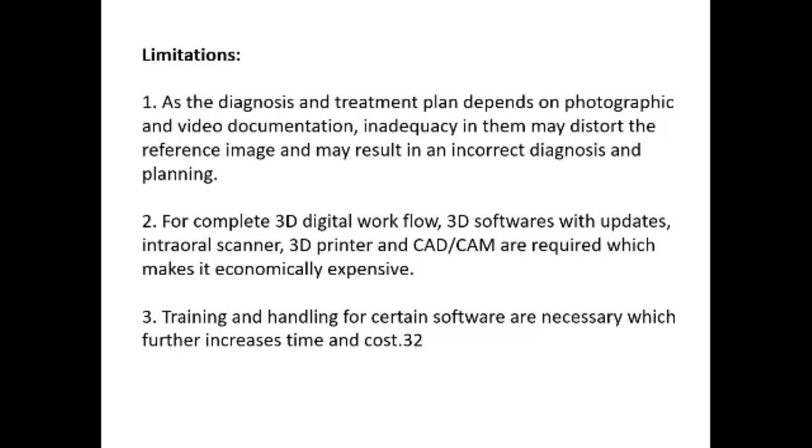But over time, if you're doing very good clinical practice, you can cover your cost within a few months to a few years. Training and handling of these softwares are necessary, and it might increase the time and cost, as I have told you. Of course, it requires some investment and some patience. If you're comfortable with it, it will transform your way of treating your patients over time.